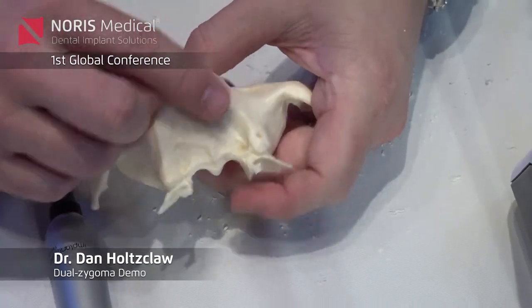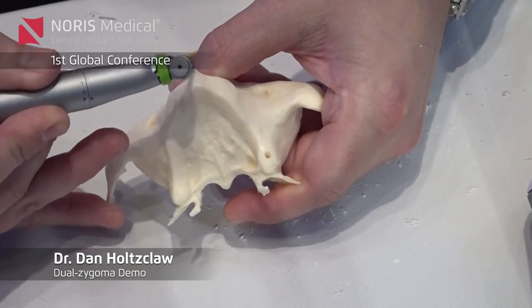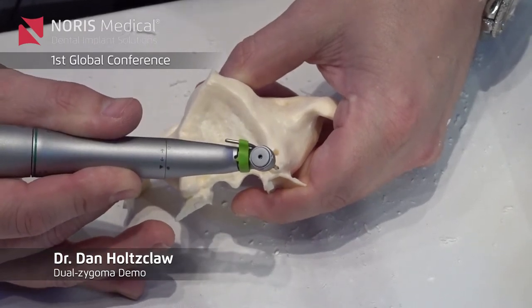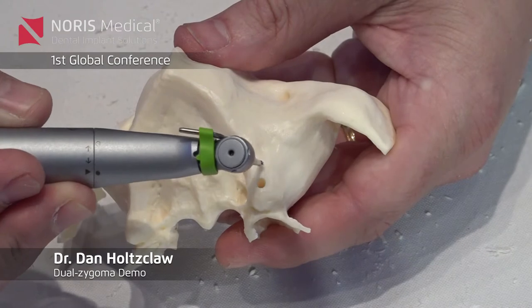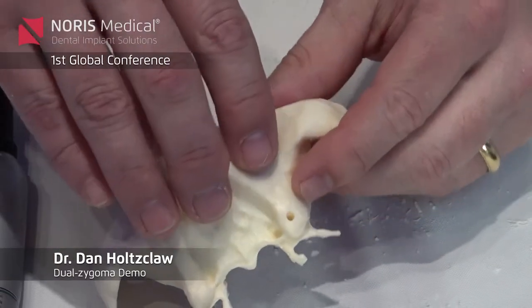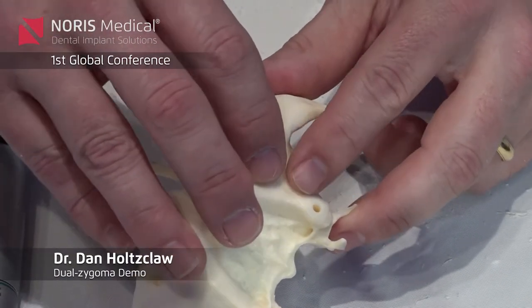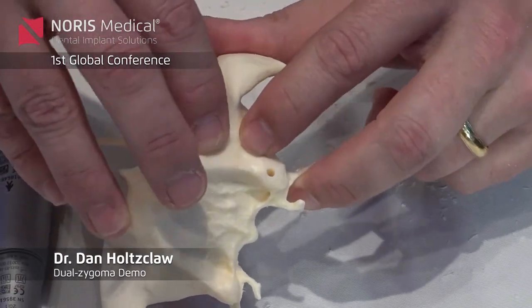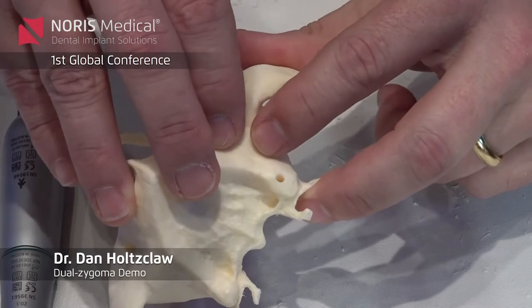If we were doing a flap and it was edentulous like this, normally I would do just a midline release, then crestal — as long as it's in keratinized tissue — all the way back to the hamular notch. Then I would feel for the zygomatic buttress, go about 10 millimeters behind that, and make a vertical release. As you start reflecting the flap, take a moist piece of gauze, put it under the flap, and put one finger on each side of the zygomatic buttress, then push with very heavy pressure to start elevating the flap.